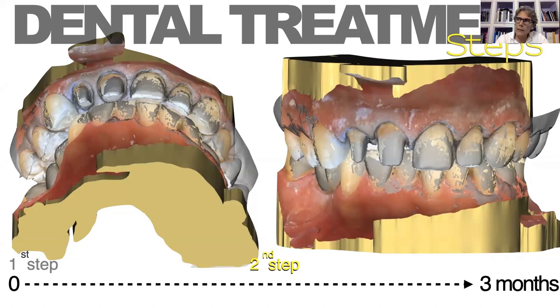Before doing that, I always check the spaces between the tooth prepared and the antagonist in order to check if the thickness of the restoration will be sufficient, avoiding fracturing during chewing after cementation of the definitive restoration.